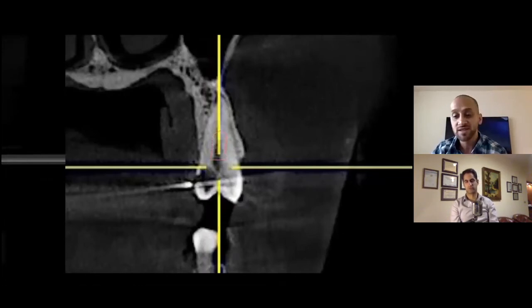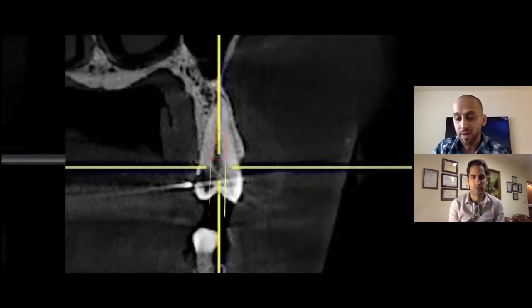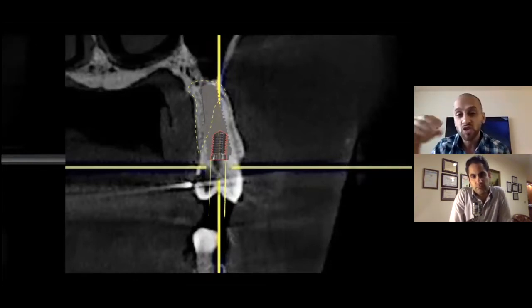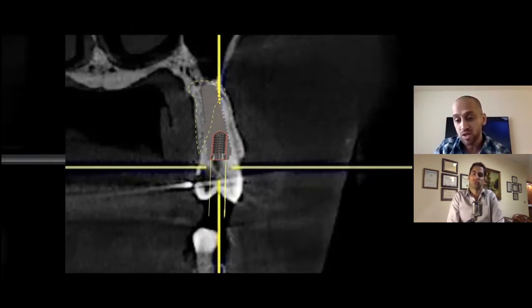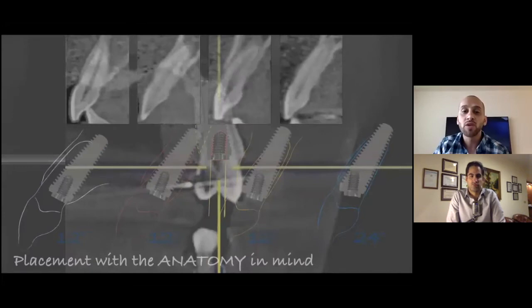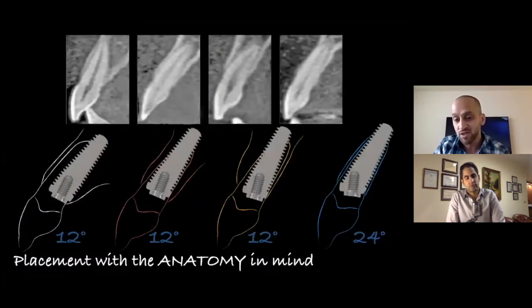So let's look at this previous scenario that we looked at. If we want to have screw retention in this prosthesis and we want the screw access hole to come out of the central fossa and right in the middle of the crown, and we still want to engage that bone palatal to the extraction socket, if we place an angled fixture where the apex of the implant is engaging that palatal bone, however, the screw access channel is 12 degrees angulated towards the palatal, not only are we going to be able to achieve very high primary stability, we can also achieve screw retention 99.999% of the time. And so when we look at the Jokan classification again, I find this fixture to be able to give us screw retention almost every time.